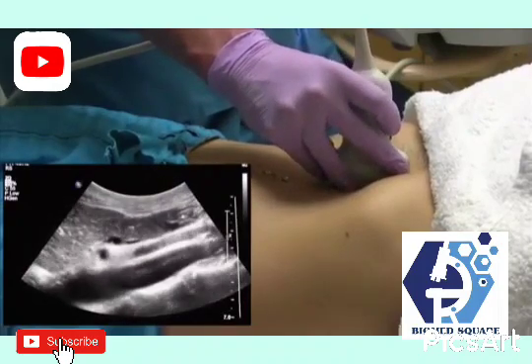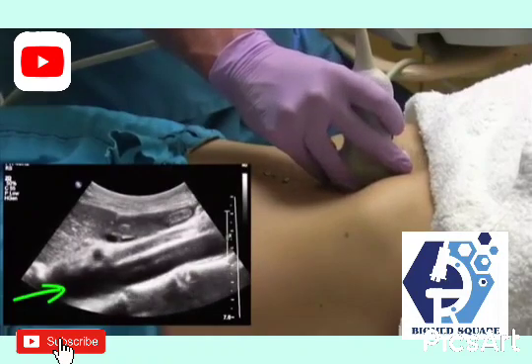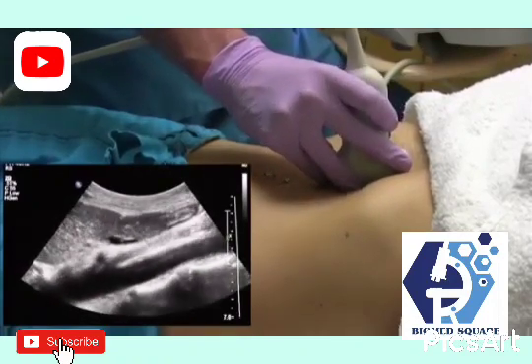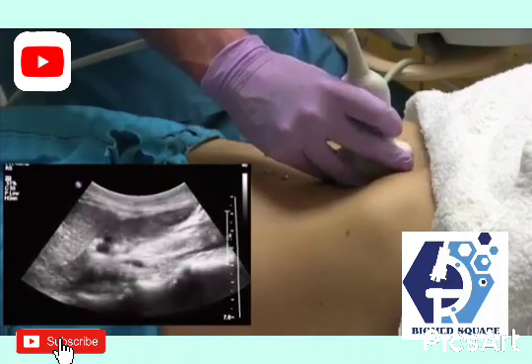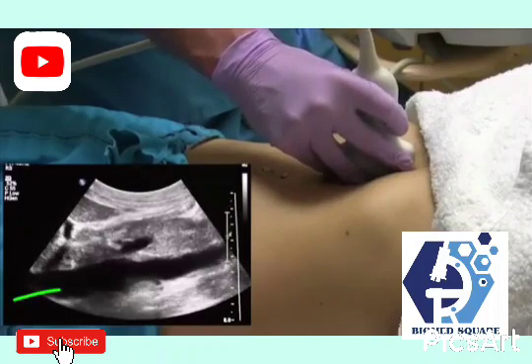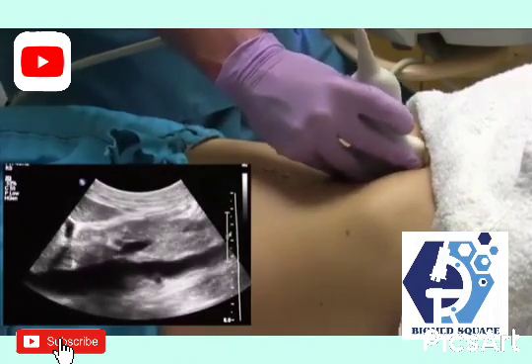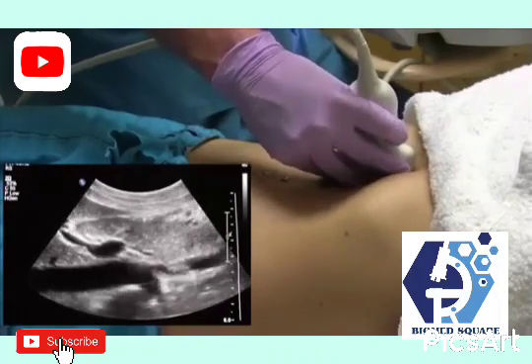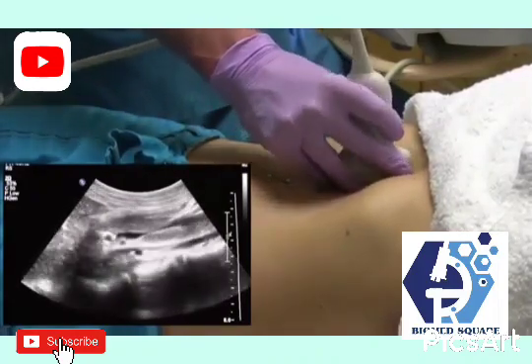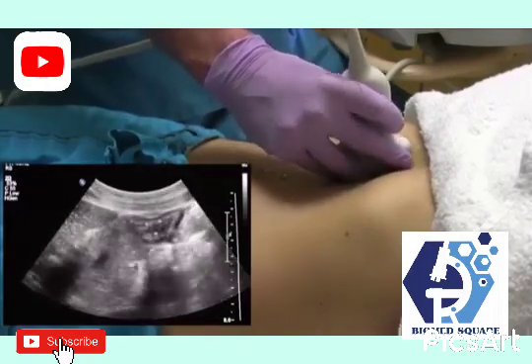So a good rule of thumb is if you're seeing the aorta posterior to the pancreas, you're in the pancreatic body. And as you sweep more towards the patient's right side, when you see the IVC, you know you're in the pancreatic head, or around the pancreatic head part. And as you sweep through, you can just evaluate the pancreas in a transverse plane here.